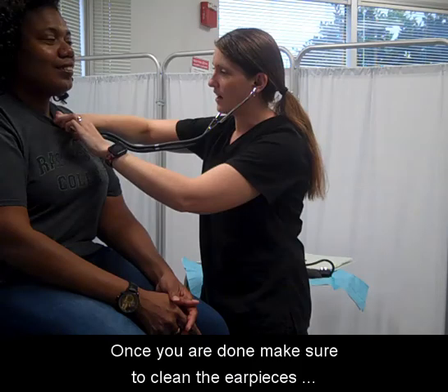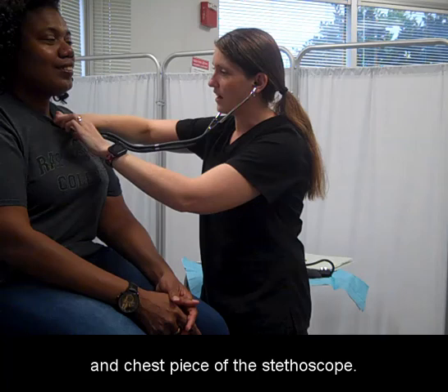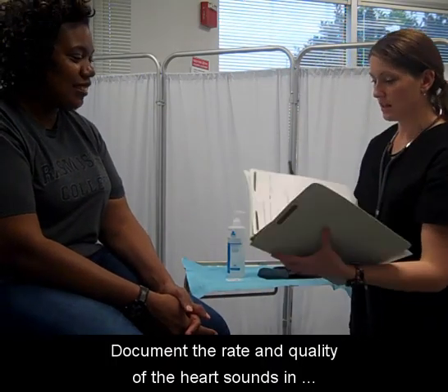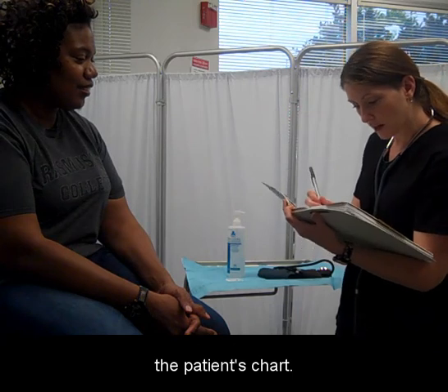Once you are done, make sure to clean the earpieces and chest piece of the stethoscope. Document the rate and quality of the heart sounds in the patient's chart.